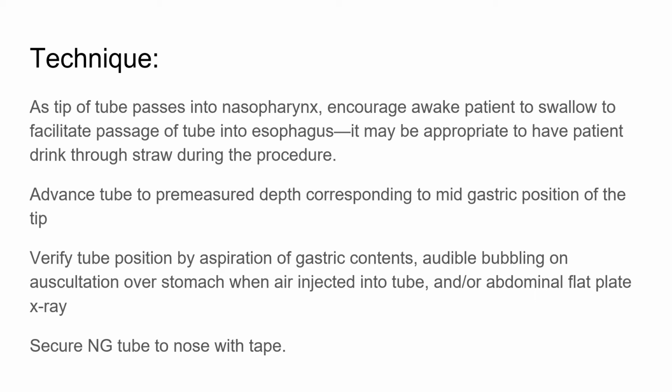Most of the time, if the patient is not able to take the command, it has to be very cautiously put into the esophagus and proceeded. It may be appropriate to have the patient drink through a straw during this procedure. If the patient is not conscious, this may not be helpful, but if the patient is semi-conscious or conscious, in such a condition, if you ask the patient to swallow as you proceed with your nasogastric tube, then it will be helpful.